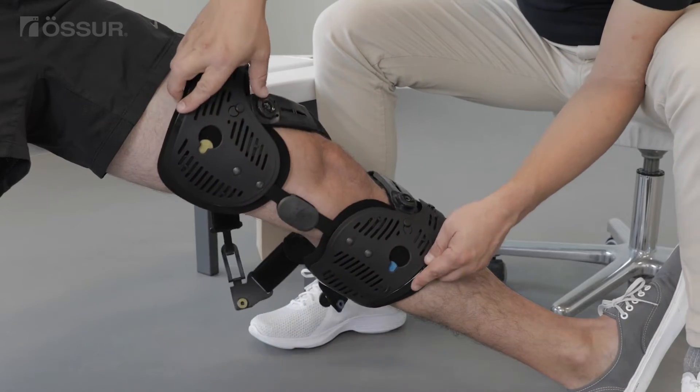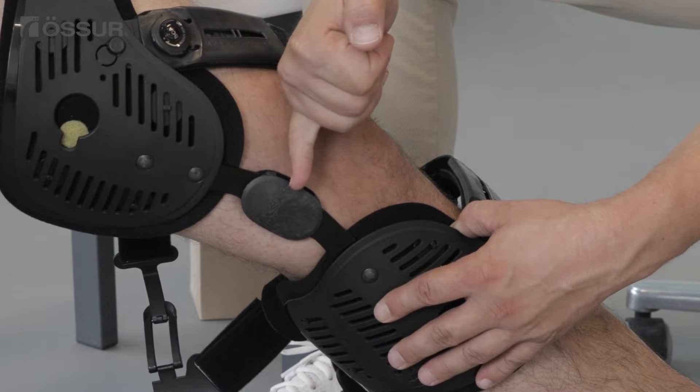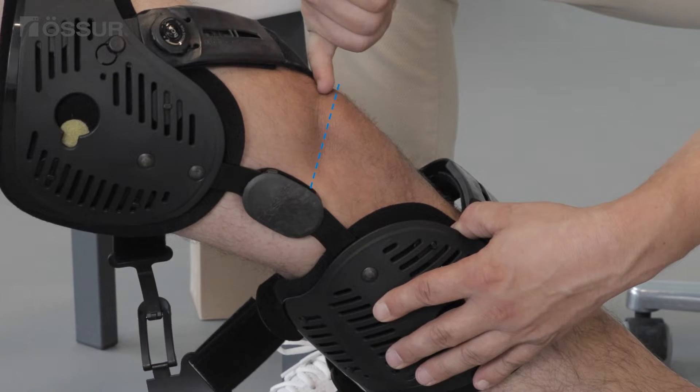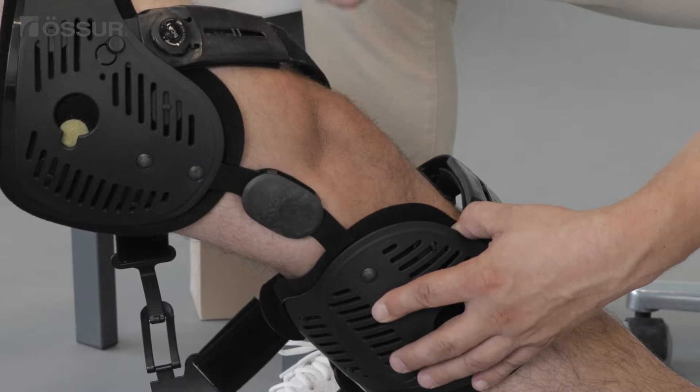Position the brace on an extended leg with the user sitting down. Align the Osir logo with the upper edge of the kneecap. The front edge of the hinge should be at the midline of the leg when looking from the side.